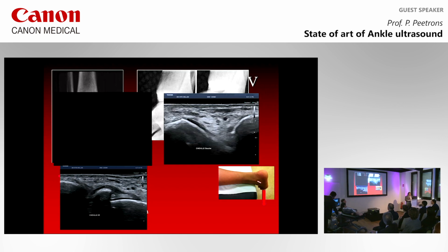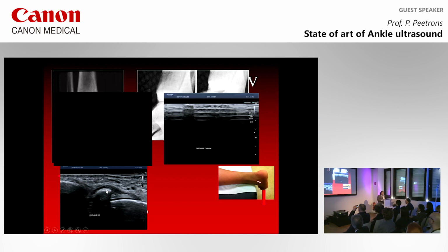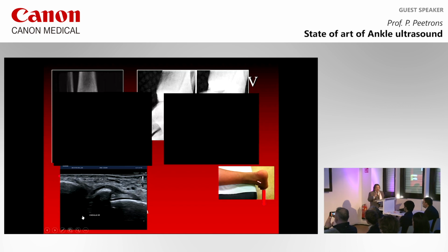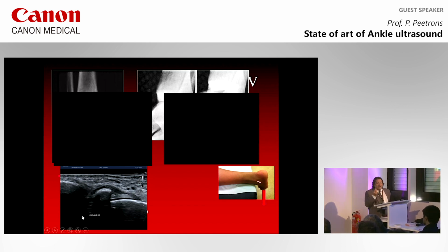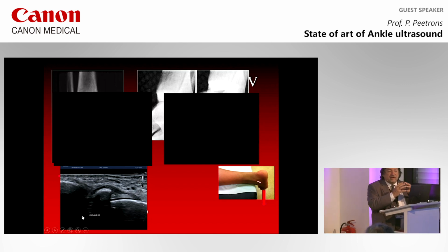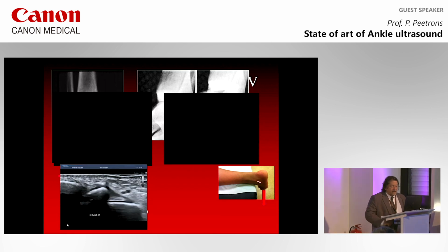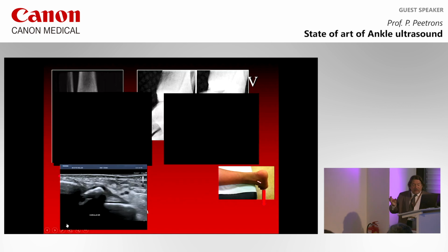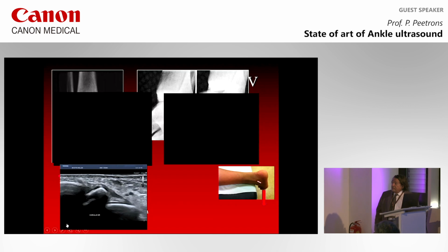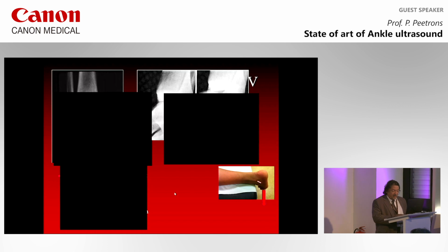This is another one where you can see that the ATFL was torn and there was a heterotopic bony fragment inside the ATFL. So is this bony heterotopic fragment a very good structure for the ATFL? Is it holding the ATFL to the fibula or not? The patient is complaining of instability, so we ask her to move. We pull the foot, and you see that this bony heterotopic fragment is completely loose from the fibula, and that there is an ATFL instability.